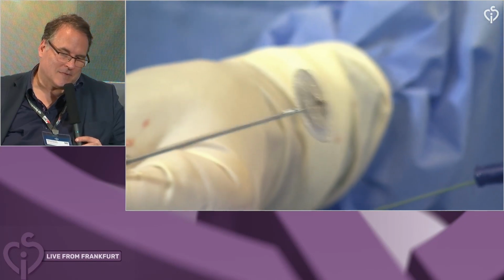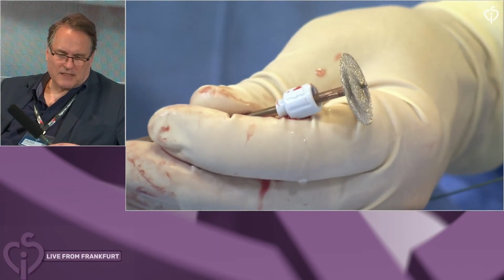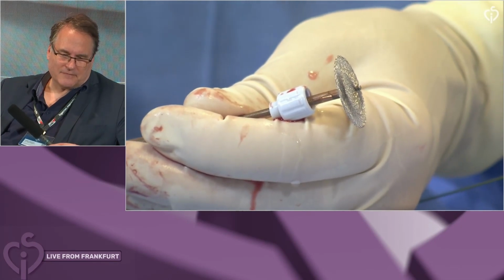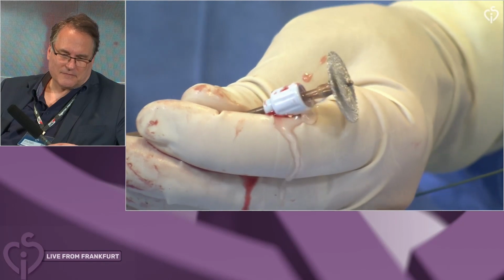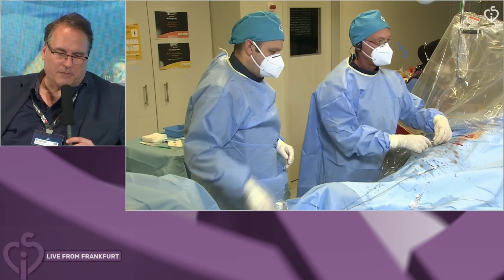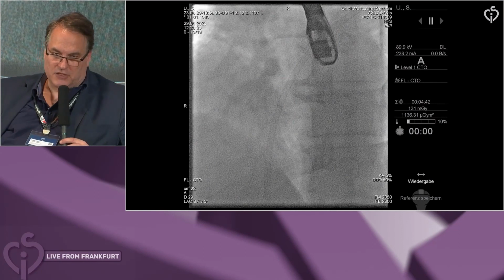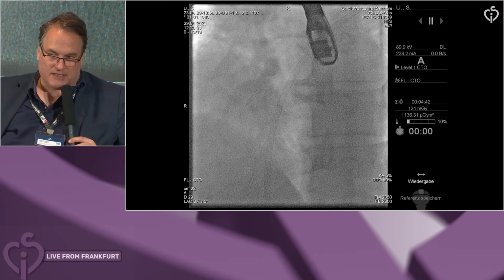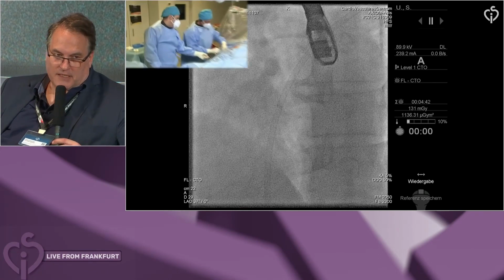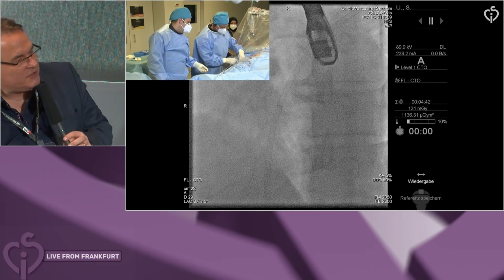It's for patients who have concerns about nickel allergy, although the Amplatzer also is not coated, but it's kind of a modified surface, so that also prevents nickel release. But we did a systematic analysis in 300 patients. Actually, the nickel release is very short. You cannot measure it in the blood. It's just 1 or 2 days. And even patients with a nickel allergy have no problems at all. Perhaps they close even faster because they just get a local inflammation, and they had no systemic response.